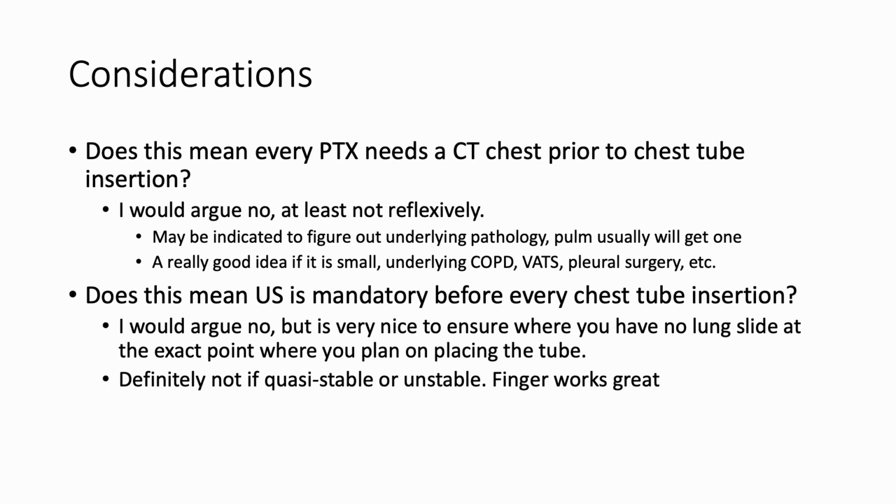I think thinking through this, I do have a couple considerations to go through. So the first thing is obviously, should we just CT chest everybody who's got a pneumothorax before we get a chest tube in? And I think that's okay. I don't think it needs to be done reflexively or as a hard rule. But I think there's a lot of reasons to do it, to figure out underlying pathology, blebs. Pulm will usually get a CT chest at some point with somebody with a spontaneous pneumothorax. So I think it's not unreasonable to do.